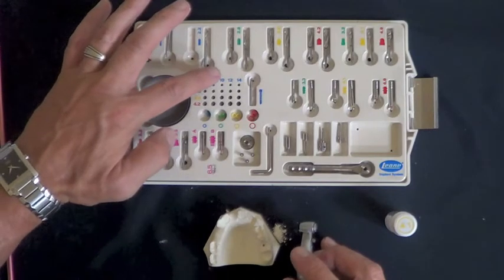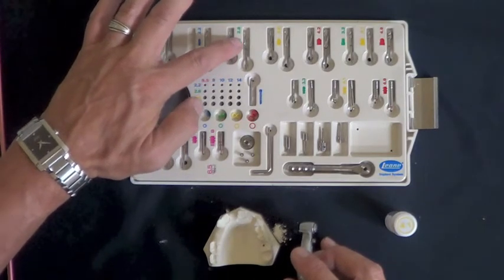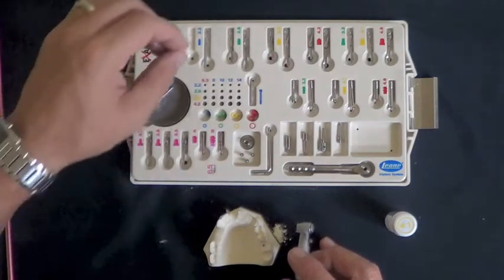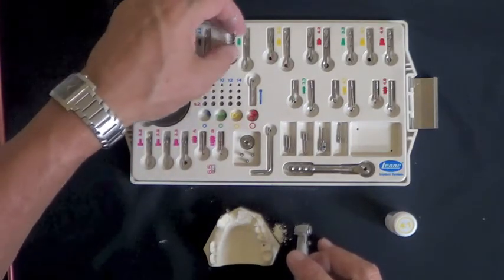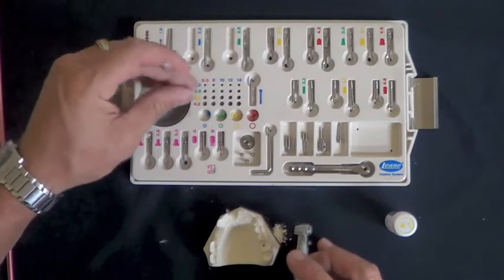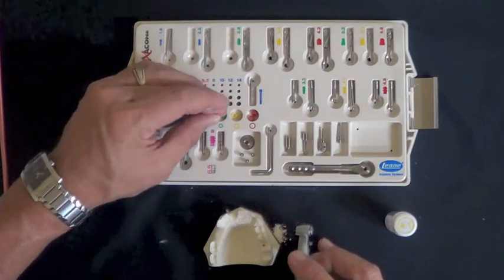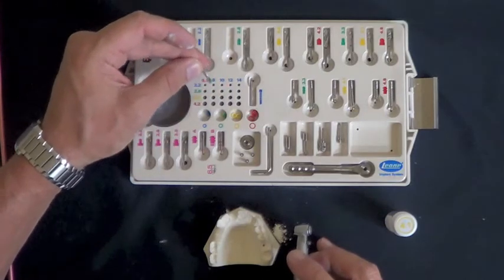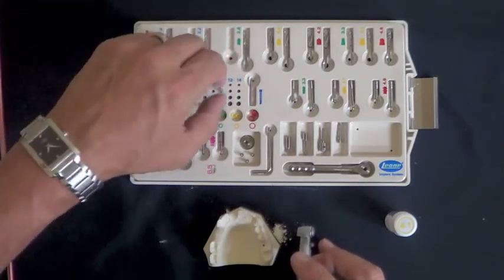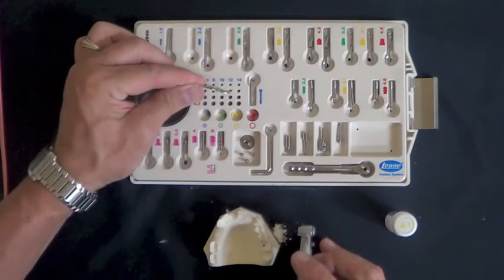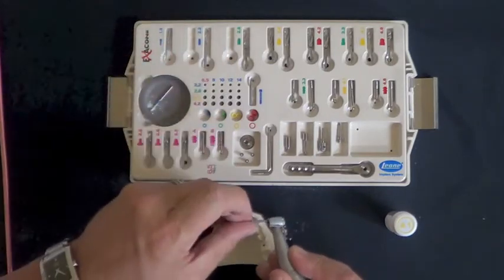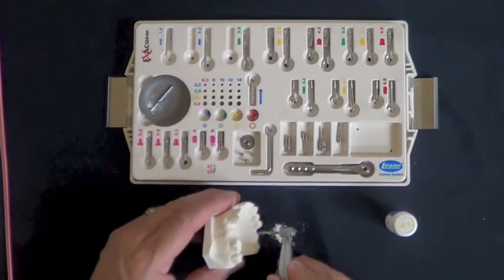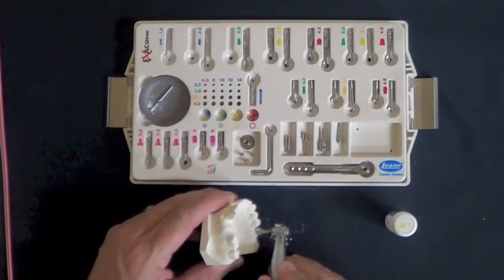Since we're placing a 4.1 implant, we would use then the 2.8 drill, and then eventually the 3.5 drill prior to placement of the implant. So the next step is to take the green colored 2.8 drill, put on the ringlet, go to the 10 millimeter mark, place the drill in the handpiece, and then again take this to the 10 millimeter mark.